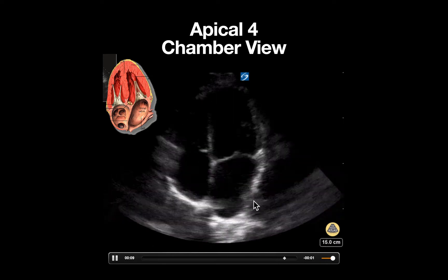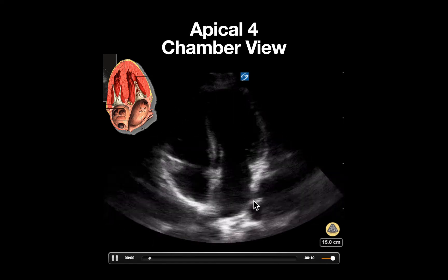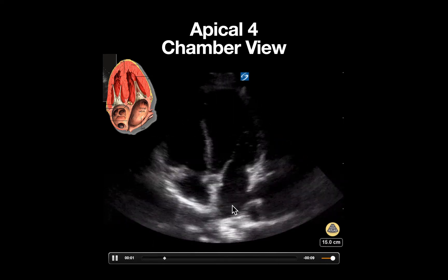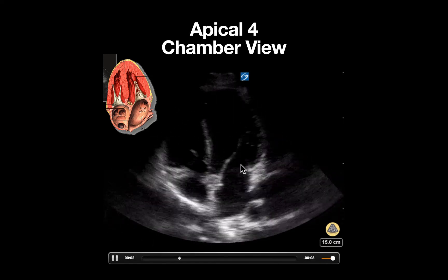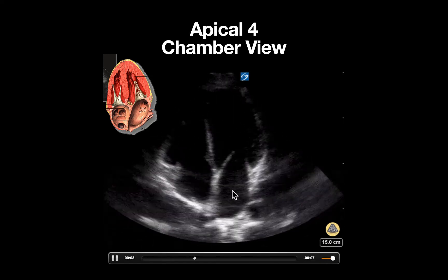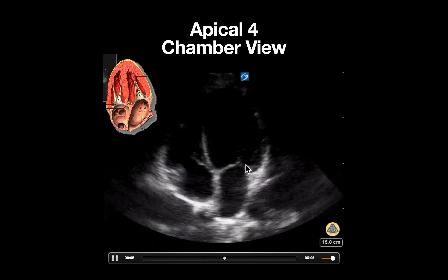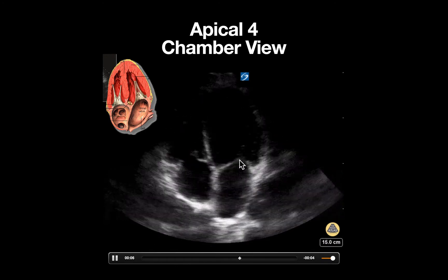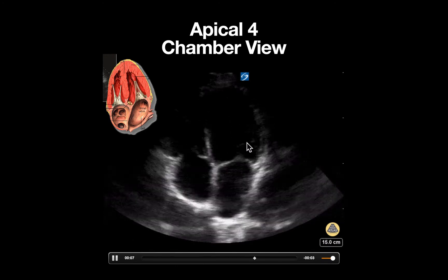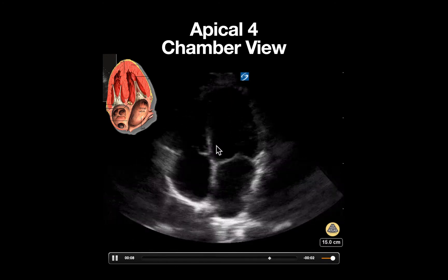In this image, we can appreciate the following. On this side, we see our left atrium, mitral valve opening and closing, and our left ventricle.